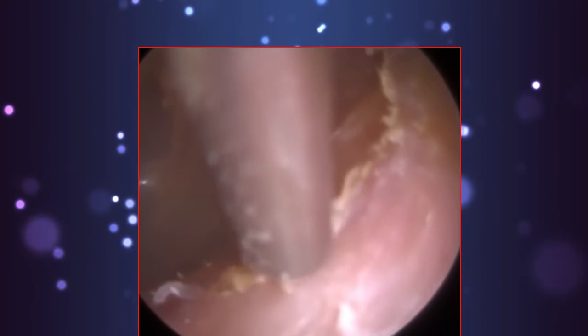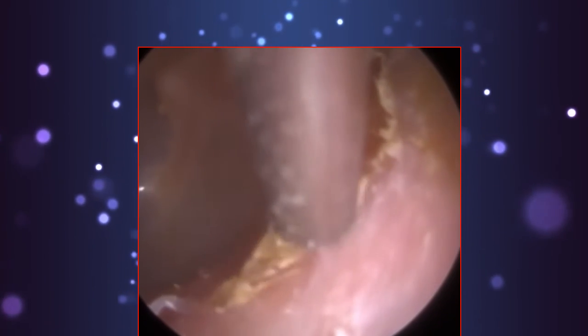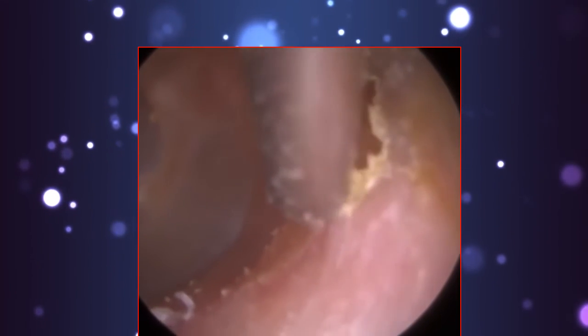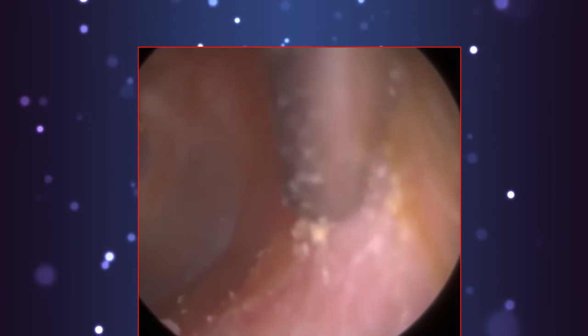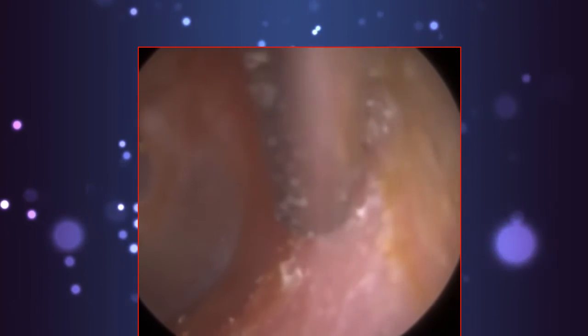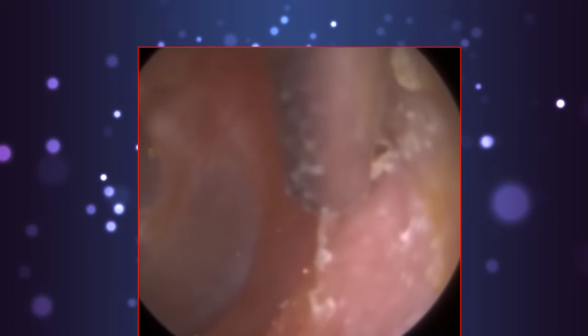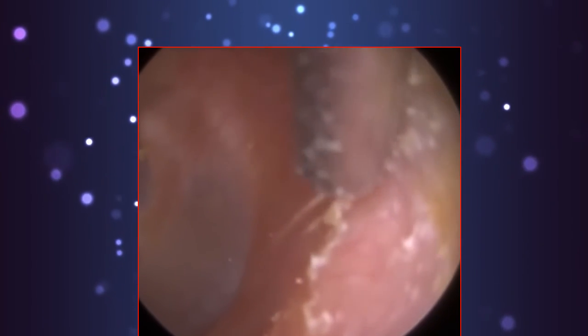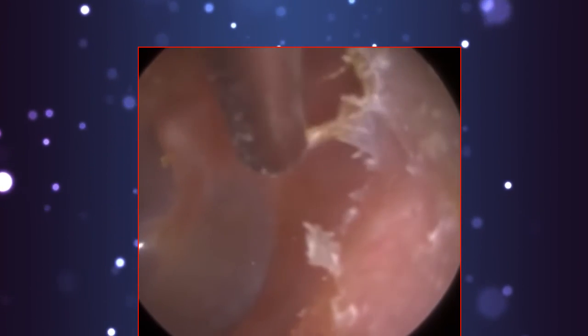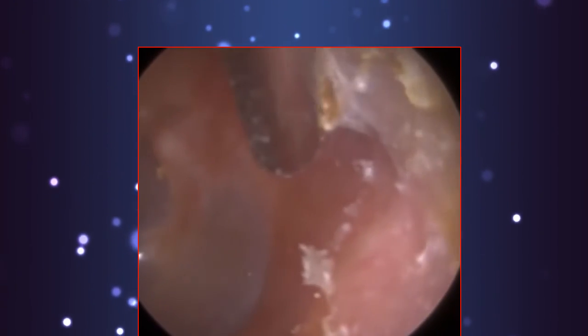And we're giving some patients some ear care tips. They are a keen swimmer as well, so we've recommended, obviously, really discussing water precautions. So some custom-made swim moulds or over-the-counter ones as well, but custom ones are better. However, they're a bit more expensive, so they're going to try the ones over the counter and then revert back if need be. The eardrum's really healthy, both sides, with a lovely light reflex.